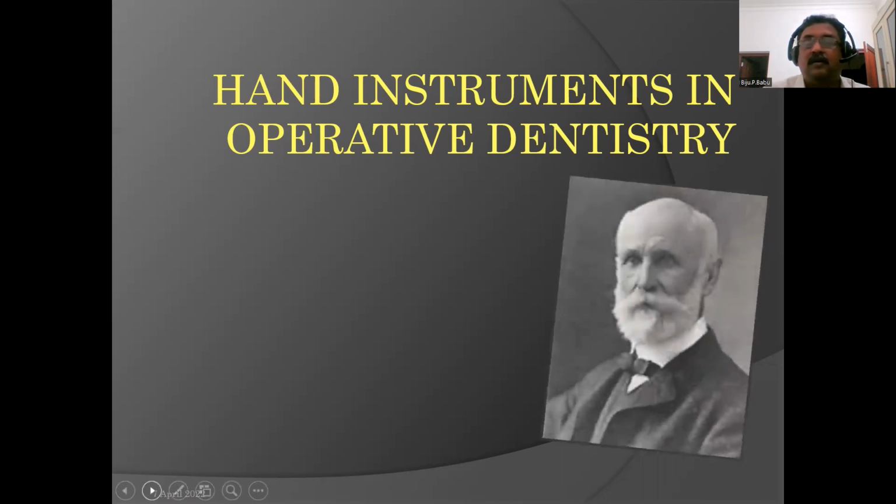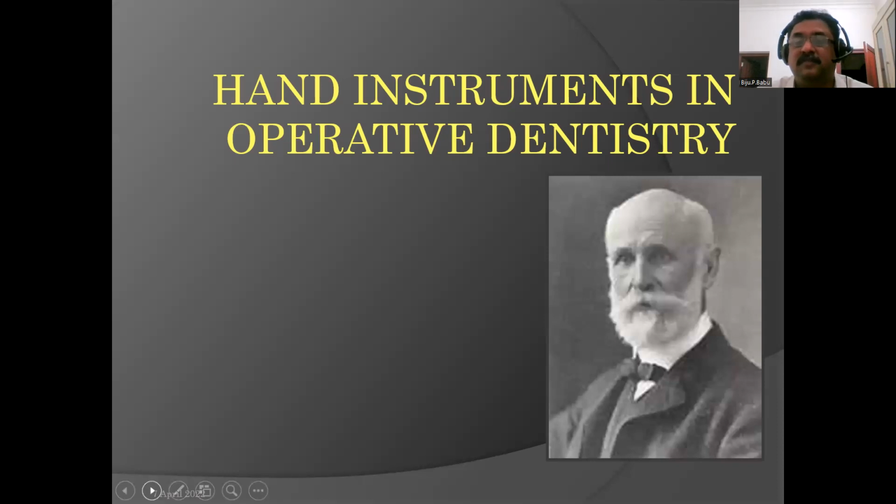Now, this is Dr. G.V. Black. He is a person who has brought in many classifications in hand instruments. Earlier, each dentist used to manufacture the hand instruments according to his requirement of the tooth preparation.